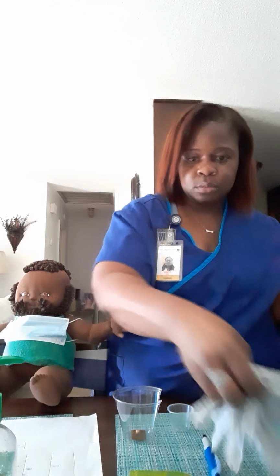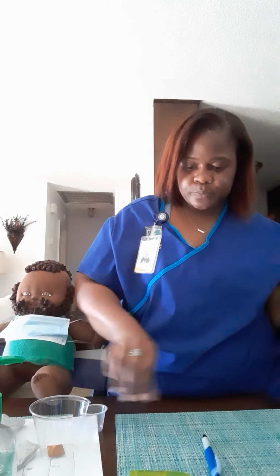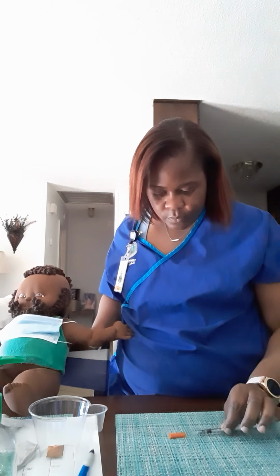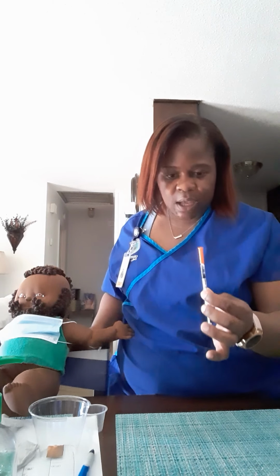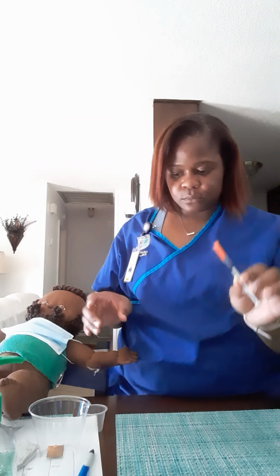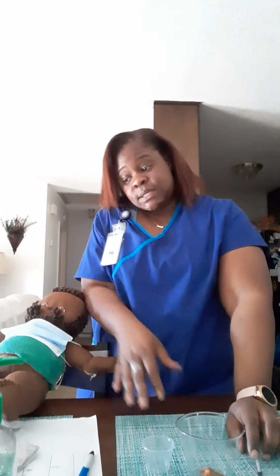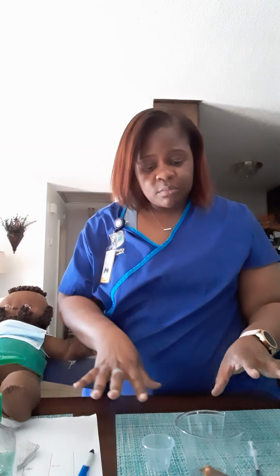And then, I would do my one-handed scoop to recap my needle. I've checked my calculations, and I'll have another nurse verify my calculations, and I would be doing my second check for right drug, dose, route, and time.